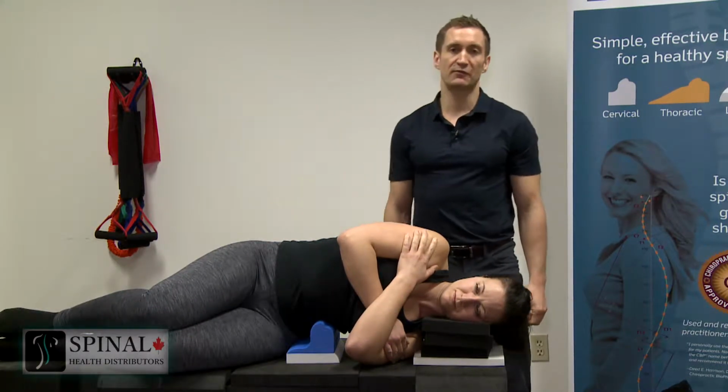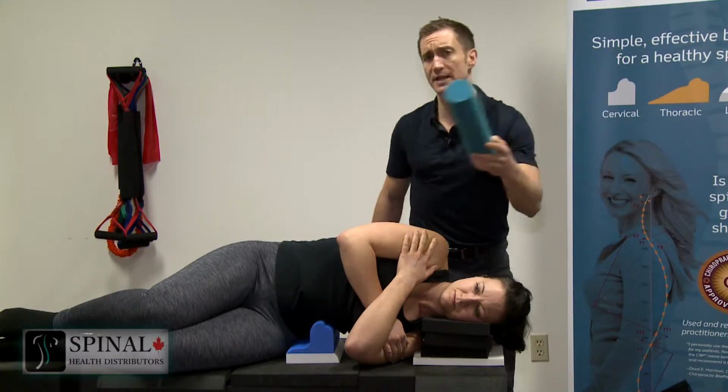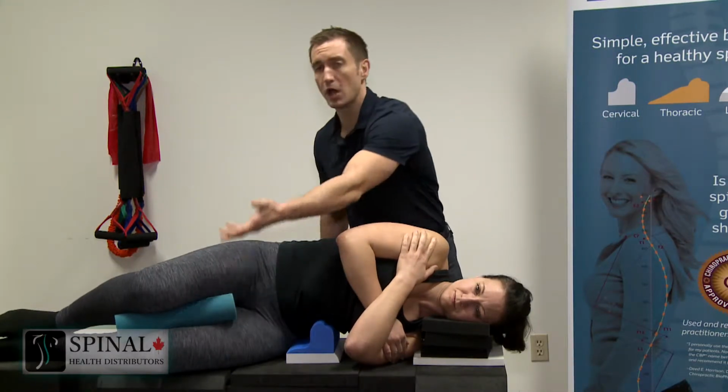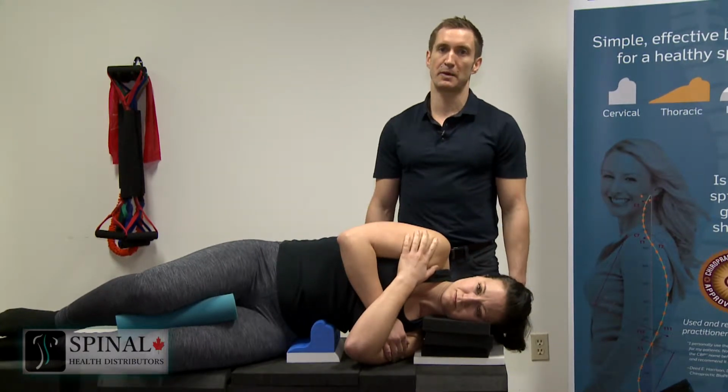And if the patient finds that it's uncomfortable on the low back or the hips, we can put something between the legs, such as a pillow or a block, to give them some support to prevent rotation of the hips and relax the low back as well.